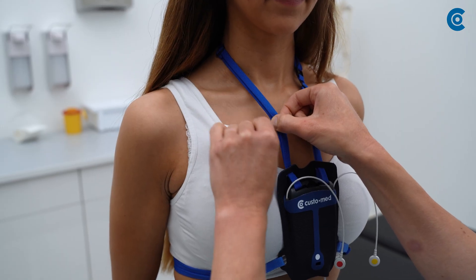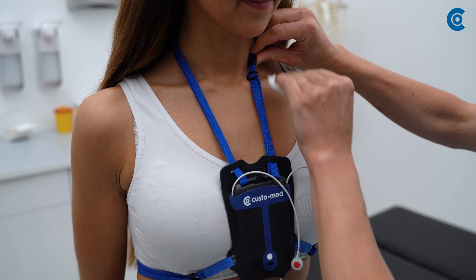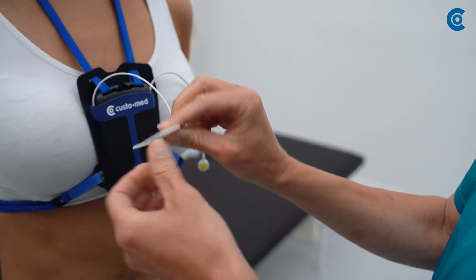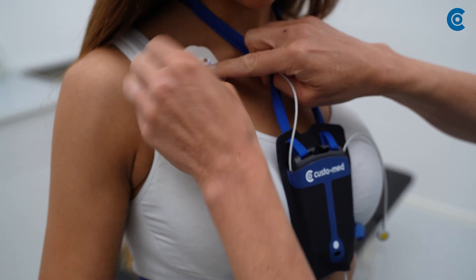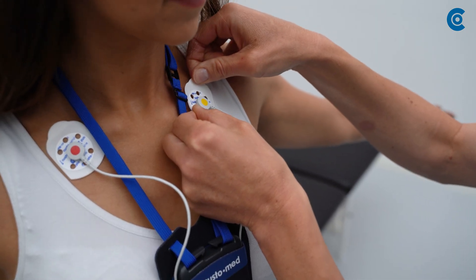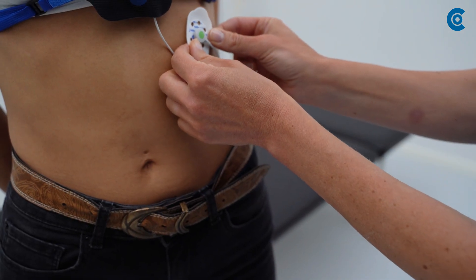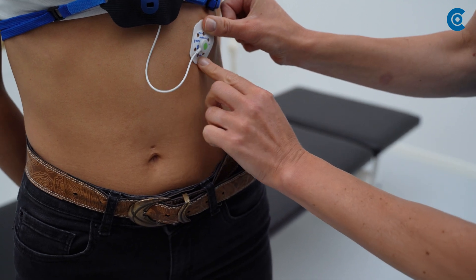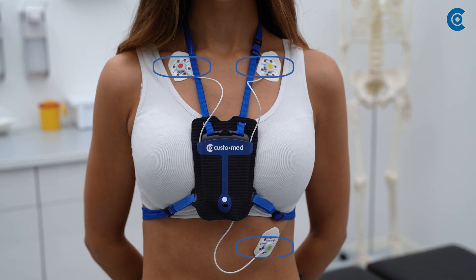Clean and dry the electrode application areas on the patient's skin with ECG Preparation Cream and clip the Custo Sensive onto the ECG leads. Place the top two electrodes below the collarbone, preferably not on a muscle. Place the lower electrode below the heart at the apex of the heart. Make sure that there is no tension on the ECG leads. The electrodes can each be applied within a specific area.